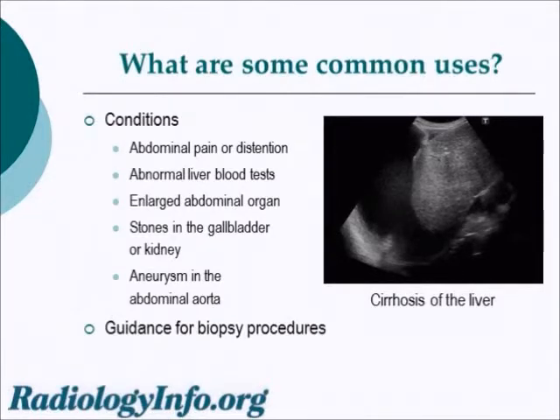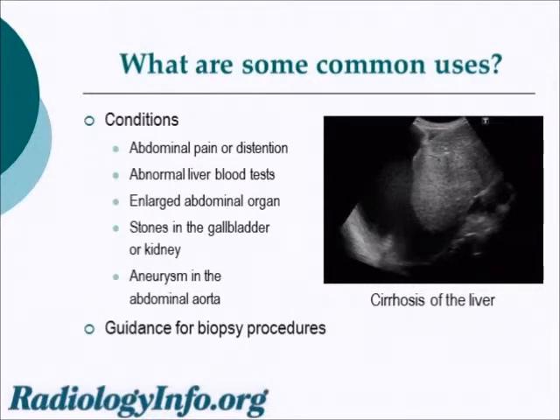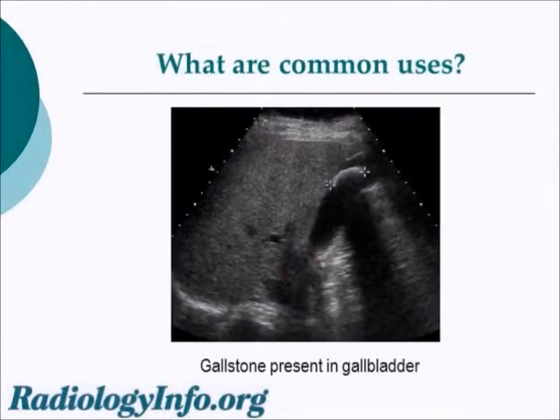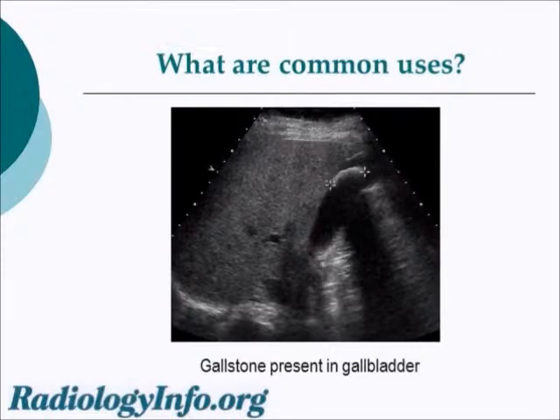In this image, the liver is depicted as the medium gray object in the center. This is a patient with cirrhosis of the liver, and the liver is abnormally bumpy and surrounded by fluid, the dark area to the left and bottom of the image. In this next picture, we can see a gallstone in the gallbladder, depicted with the plus signs at either end of the gallstone. The gallstone is sitting in the gallbladder, the diagonally oriented black object.